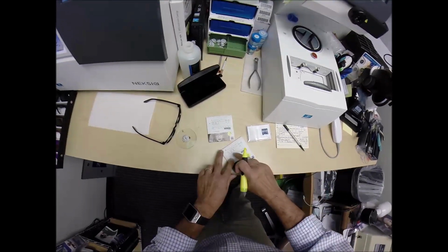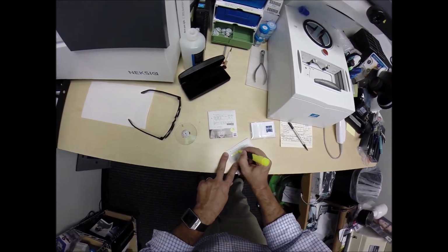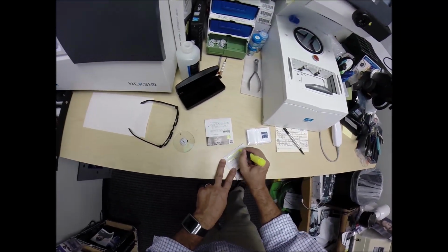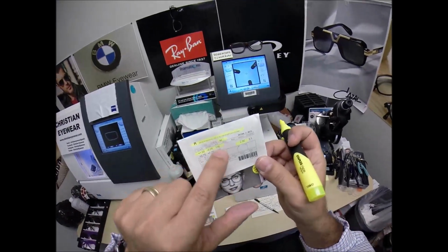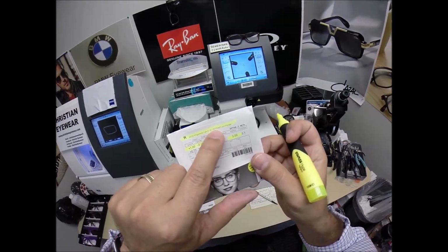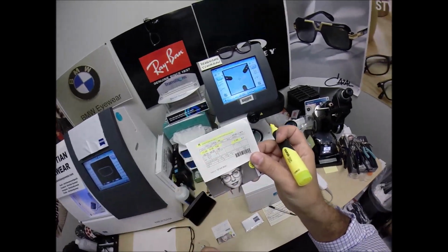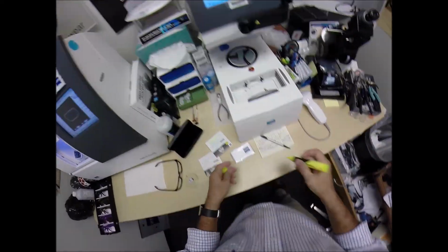The prescription for my right eye is +1 minus a quarter at 136, my bifocal strength of 2. I highlight that these are the Zeiss Progressive Light D18 1.59, which is the refractive index of poly, and it says PhotoFusion Pioneer, which stands for the Pioneer Green. The DO stands for DuraVision Chrome Anti-Glare.